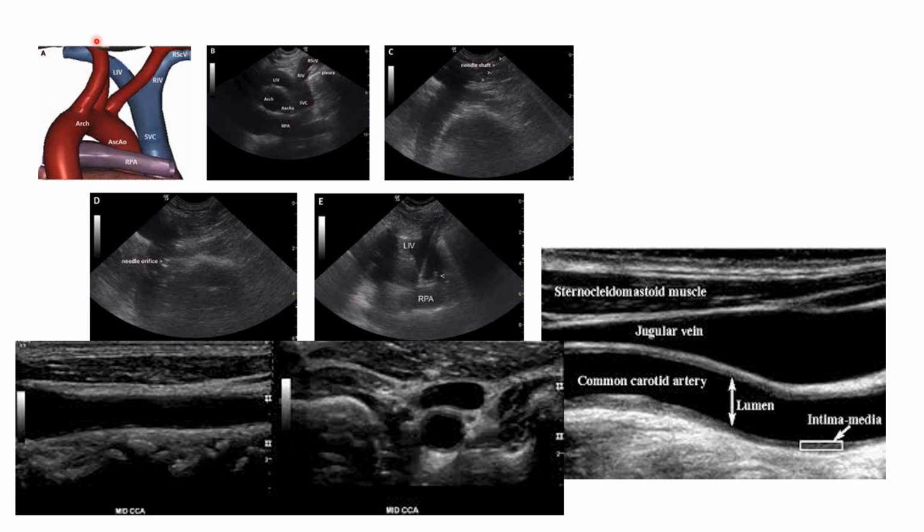Okay, now if we look here, you can see this is actually the aortic arch. They've had to really increase their depth here to kind of catch onto that arch, but that's kind of what you're looking for. If you can get that image, if you can put color in there and then document the subclavian and the carotid coming off of there and take Dopplers in those three general areas, that's going to tell you that you really got to the origin of the vessel.